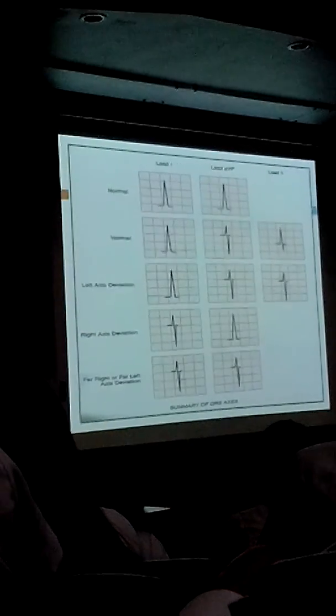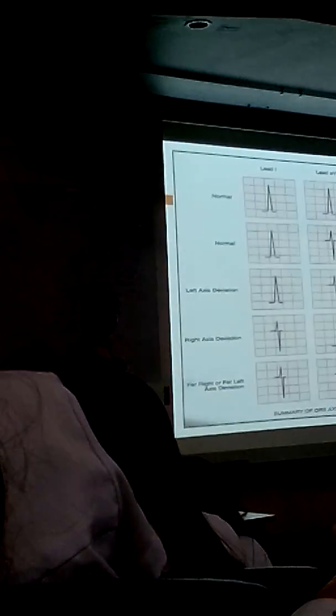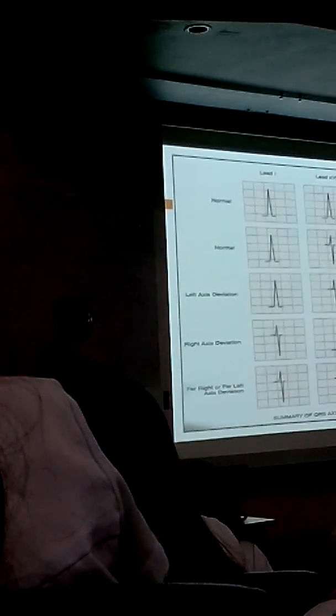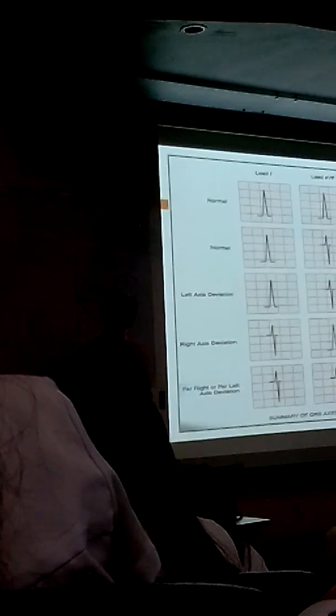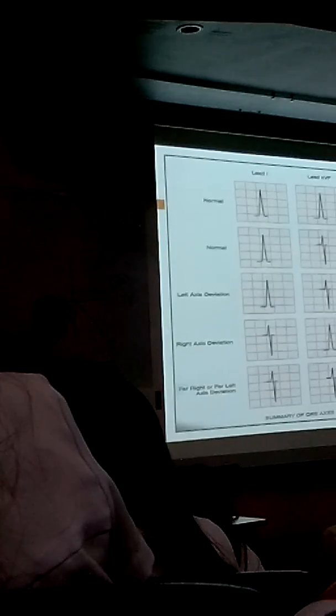So you can say that this is still normal. How about when we talk about left axis deviation?